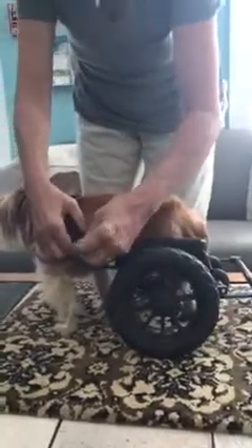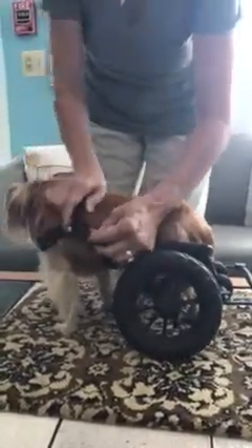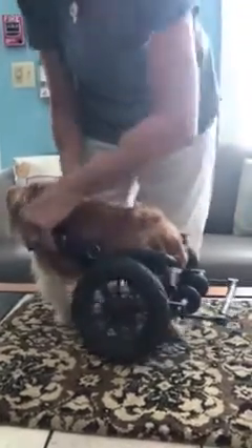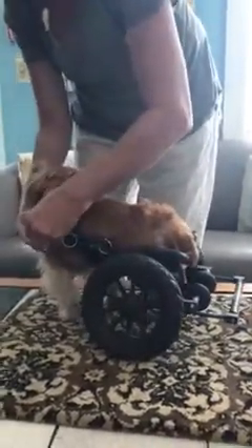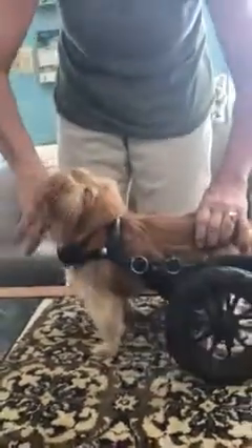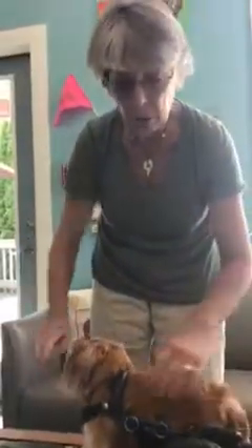It's very important that the yoke be as close to the dog's withers as possible without putting any pressure on them, and the chest strap be loose enough so that as the dog walks forward they can stretch out and their spine can lengthen. Dogs that are roaching will actually decompress their spine and get longer. That's all there is to it.